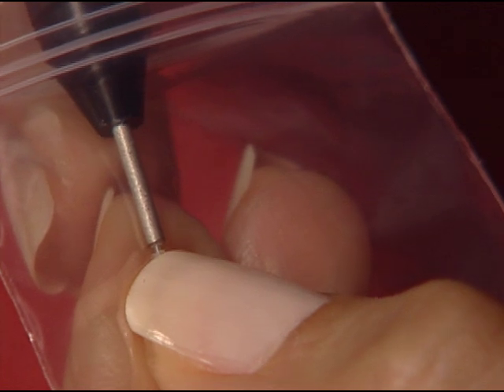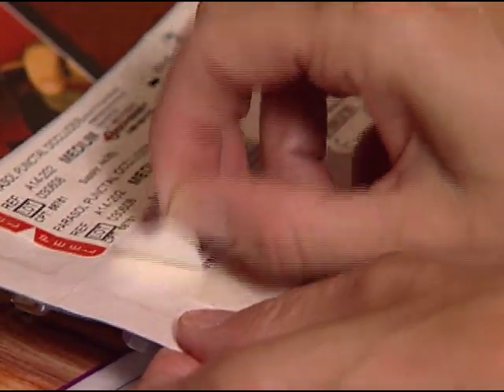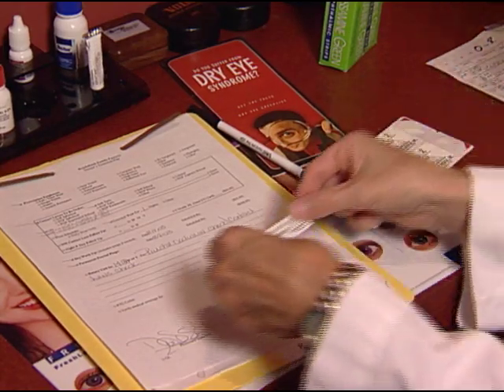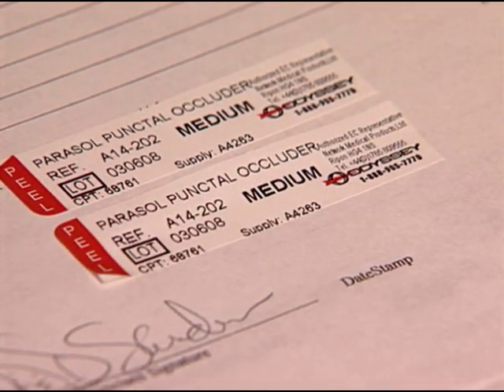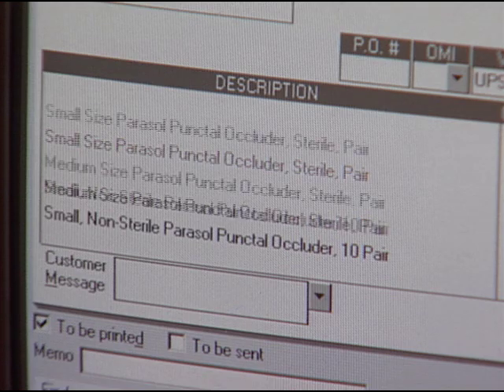Or, you may simply load the occluder onto the inserter directly from the bag. For your convenience, with each pack of occluders, Odyssey provides handy peel and stick labels with the plug size, lot number, and coding information. They can be easily applied to a patient's file, billing record, or surgery notes.